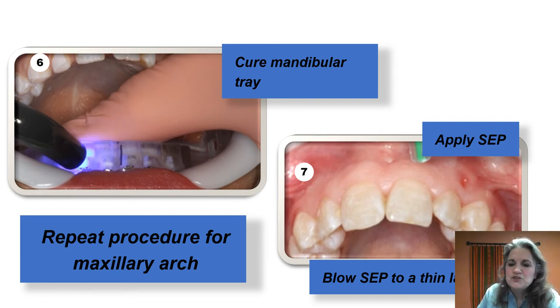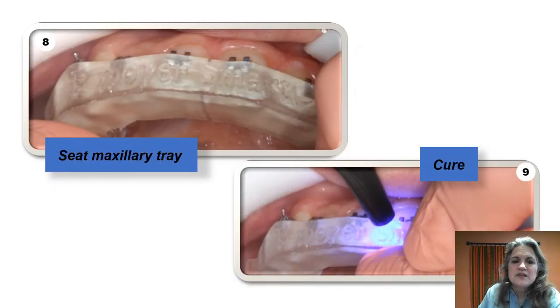Now repeat the procedure on the top. You've already etched the top, so go ahead and apply the self-etching primer, blow it into a thin layer, and I recommend blowing toward the incisal edge — not interproximally — so you don't have that issue with the tray. Seat the maxillary tray and continue with the cure. Where the tray stops you'll still see the gingival bracket just above the slot — that keeps the bracket in place, gives us access, and lets me confirm the brackets are staying secured as I seat the tray.